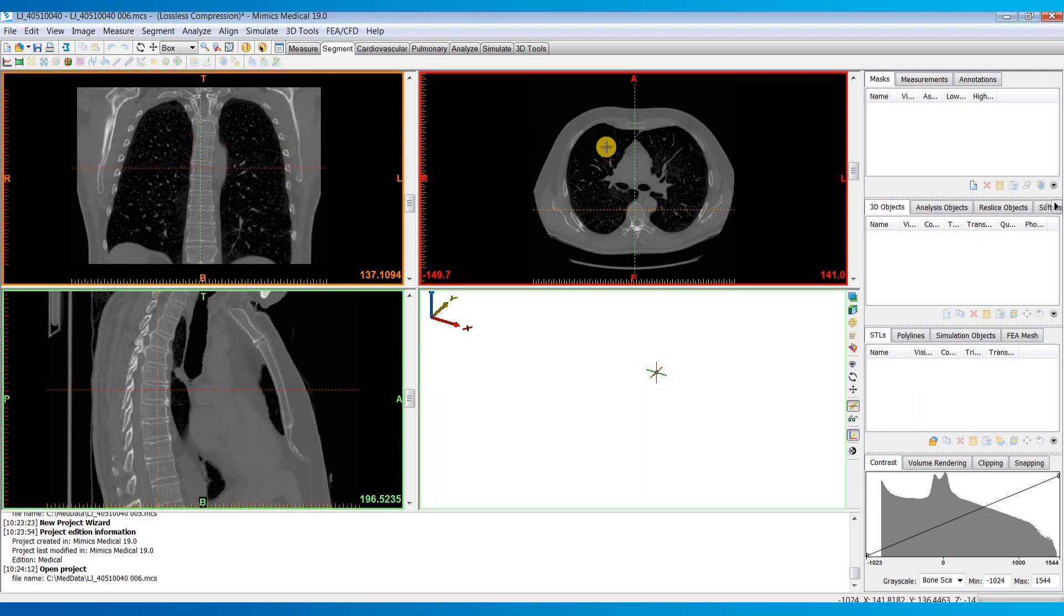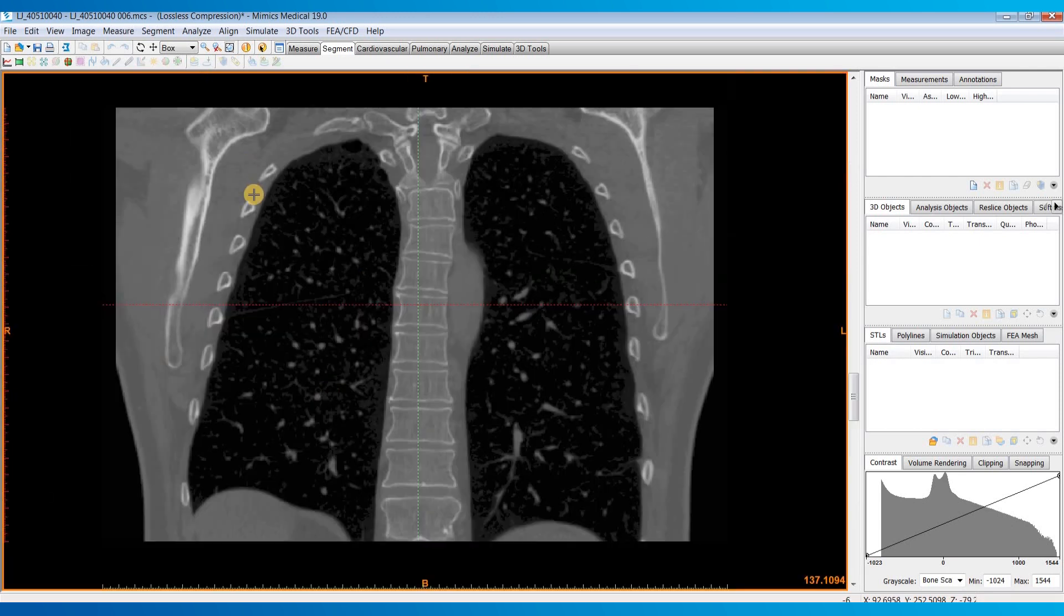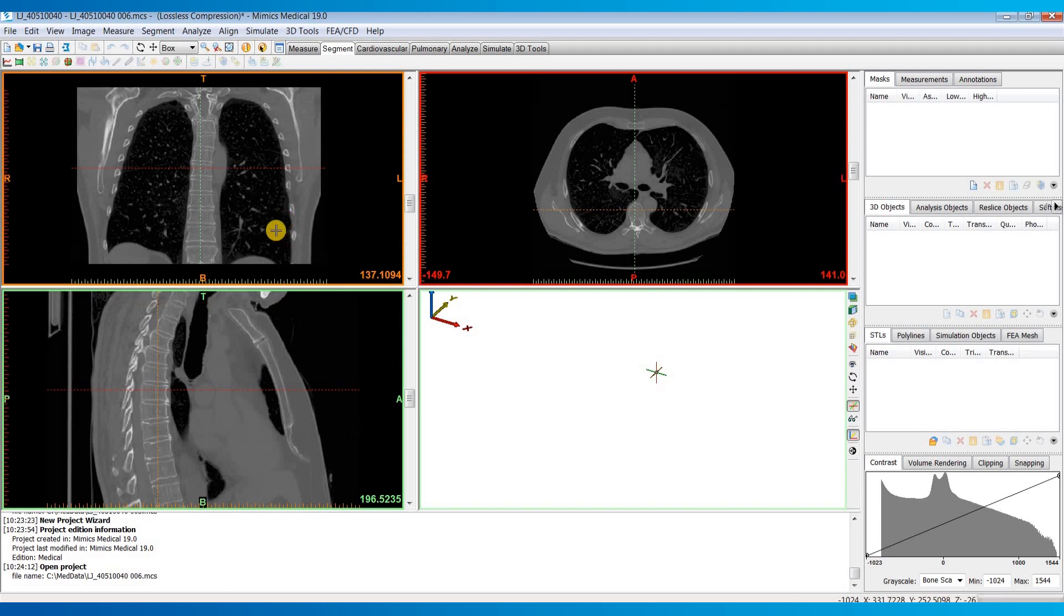If you'd like to bring up any of these screens full screen you can put your cursor over it and hit the space bar and that will bring up that plane full screen.